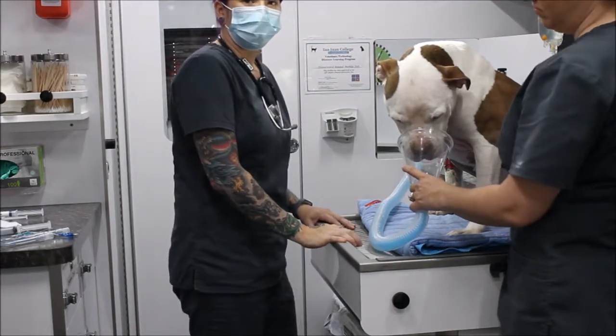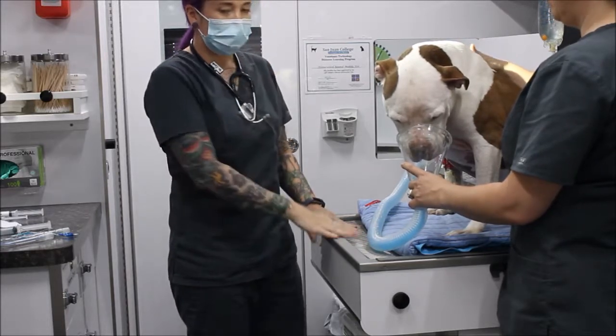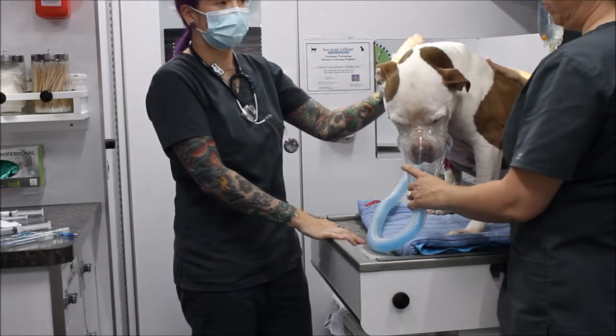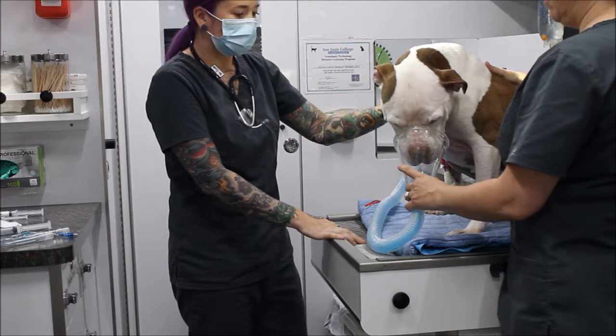In this video I'm going to be doing a rapid sequence induction on my patient. Prior to surgery, my patient has been pre-oxygenating for probably about five minutes, so while he's getting about another minute or so, I'm going to make sure that I have everything I need together.